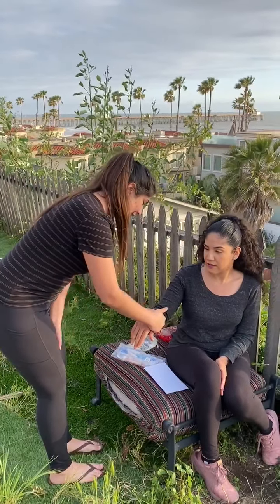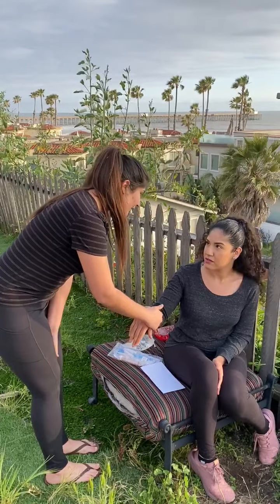Today I'm going to be doing blood transfusions. I'll come in — knock knock. Hi, I'm Diana, I'm going to be your nurse today. How are you doing? I'm going to go ahead and wash my hands first. Can I get your name and date of birth, please? Rubikyria, 1/30/85. Do you have any allergies to any medications? No.